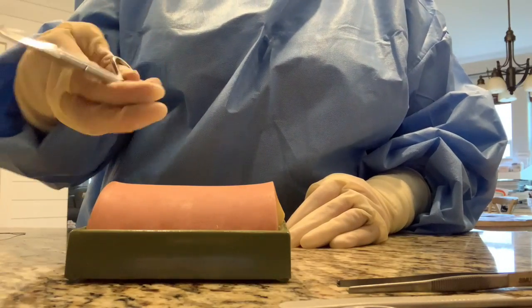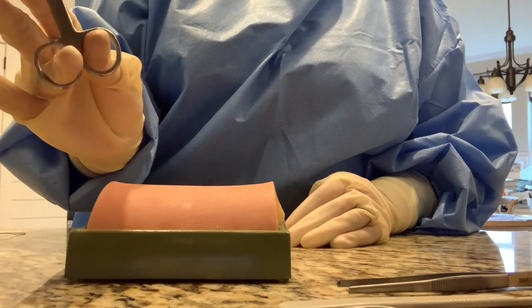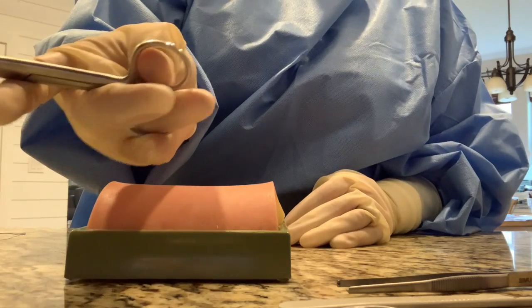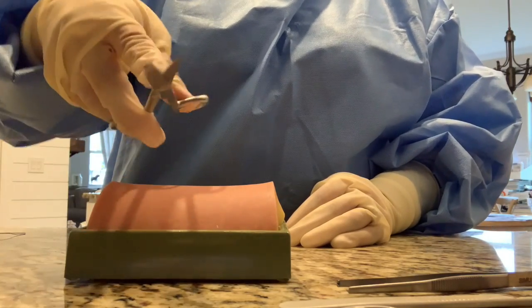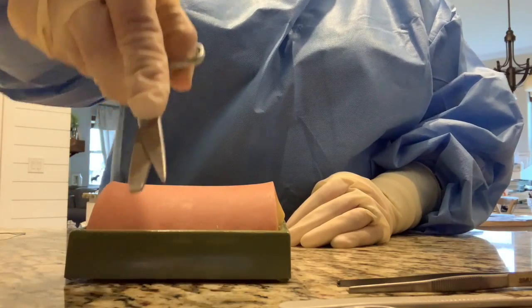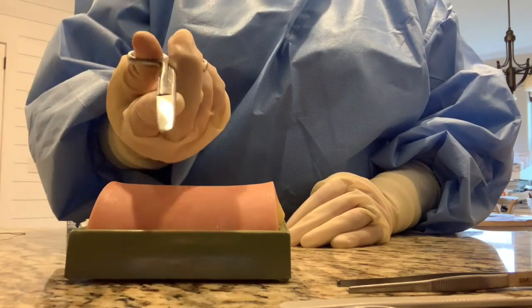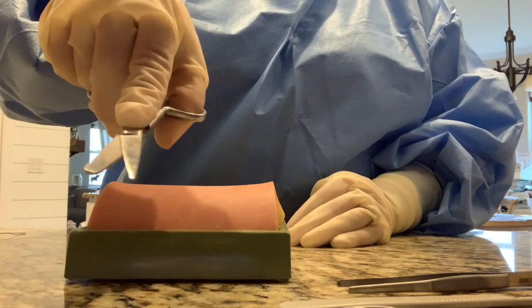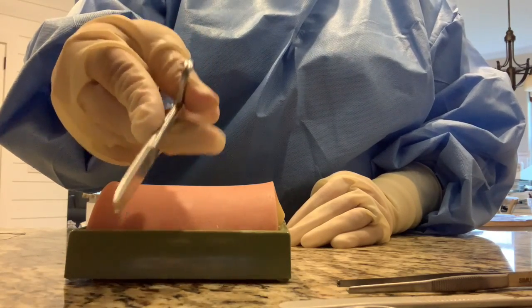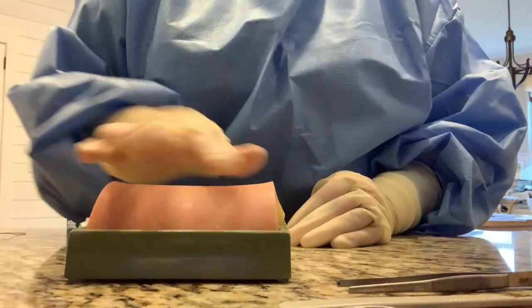Scissors - you grab them the same way, with your index finger stabilizing, and your ring finger and thumb through the holes, so you can have complete stabilization. You can go in like this, or like that. Then when you go in, you rotate and snip the suture, which I will show when I am suturing my skin.